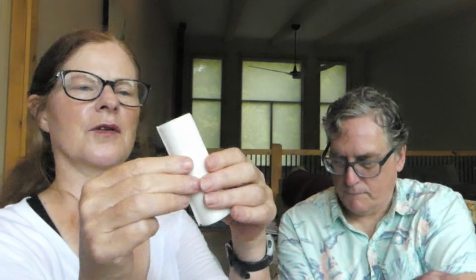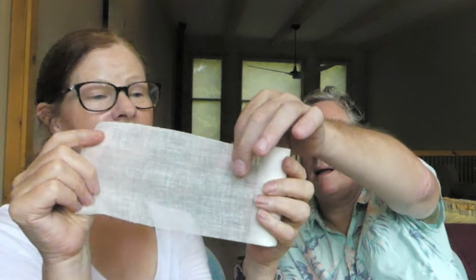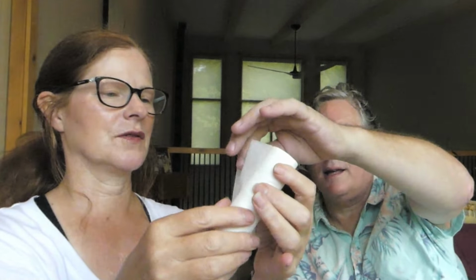Well, usually with a mesh, you'd rather have a gauze underneath it because it's not going to be very absorptive. But it's a different texture than what I am used to altogether. It is a different texture. But it's more for a wrapping. It's more like linen, isn't it? Feels a bit like linen. Yeah, it's not going to be absorptive, it's just going to be for tying things on. So, and I see something with this one that's way superior to the modern versions.